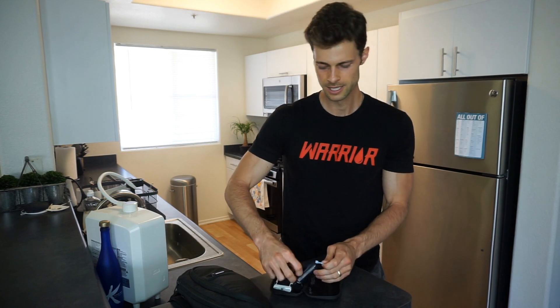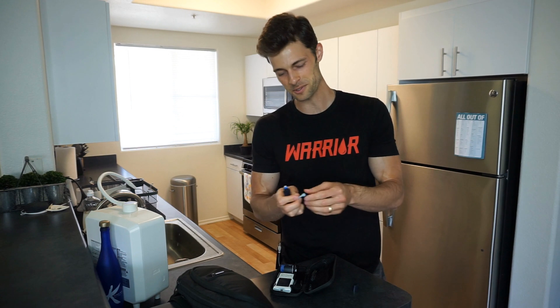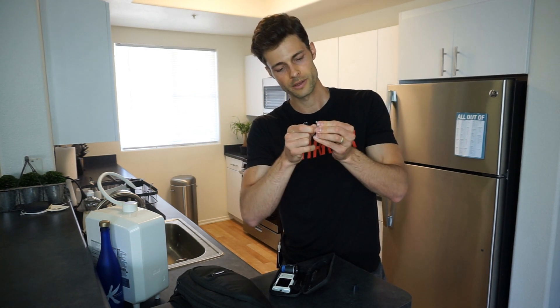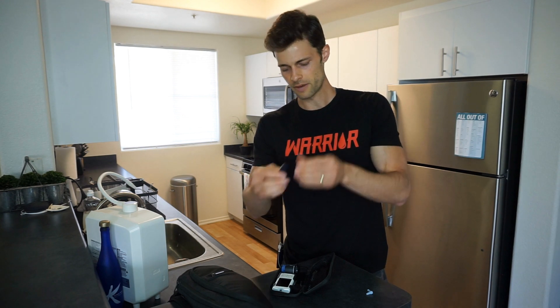I'm going to take out this little lancet and switch it out. This is something you should be doing at every single blood sugar test, but a lot of us don't do that admittedly. So I'm going to go ahead and replace it. We put it back in — depending on your device it's going to look differently, but that's all it takes. I'm going to cover up the old needle with the cap. Now it is covered and there's no needle poking out that's going to stab someone in the trash can.